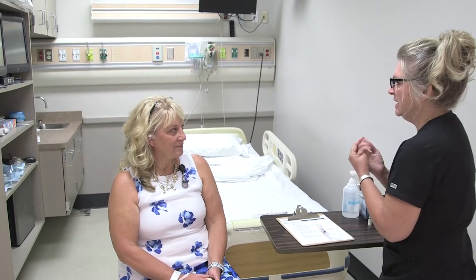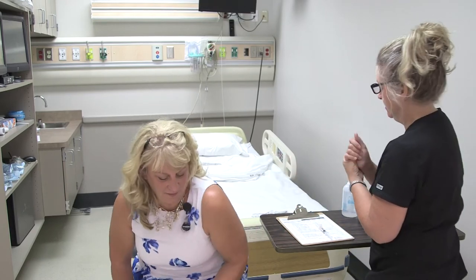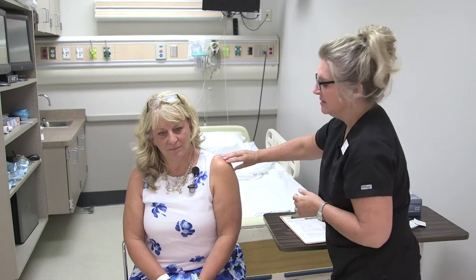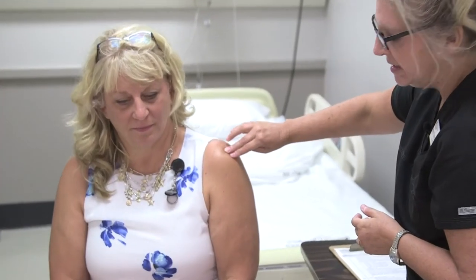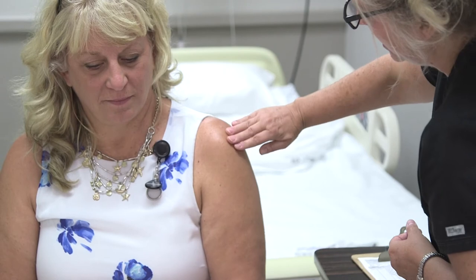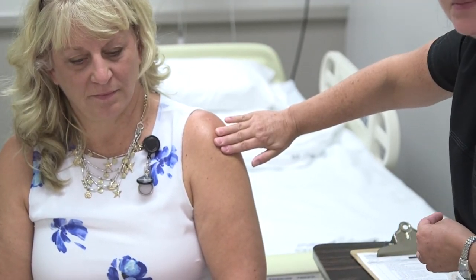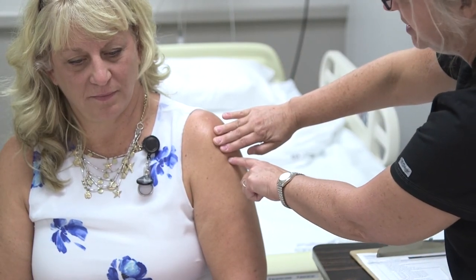And we're going to be giving it in your left deltoid there, okay? So when we do that, we have to find the right site. So you're going to find the acromion process, which is right here. It's kind of that hard bone that's right on top of the humerus here. And you're going to take about 3 to 4 finger widths below that. So approximately right there is where I'm going to be giving the medication.